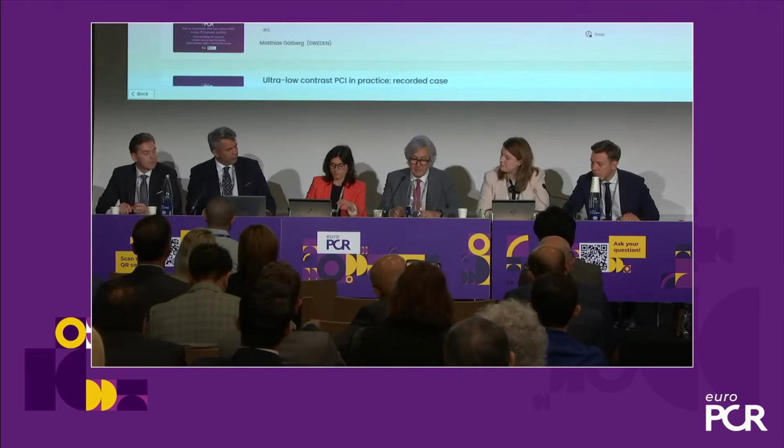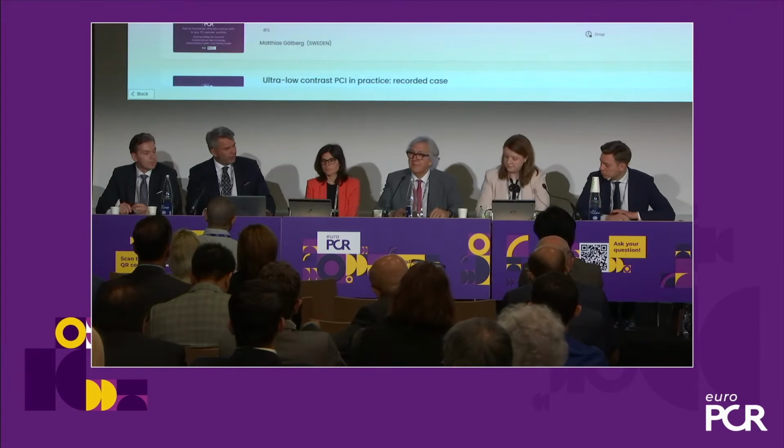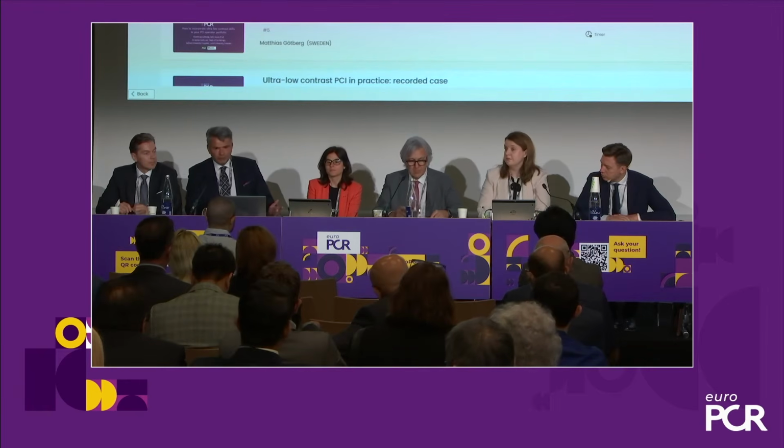And from there, trying to understand what the situation is, and perhaps proceed as much as you can without injection. In the right coronary artery, you can use 1 or 2 injections. But it's a good example that certainly these patients with an acute coronary syndrome are the ones that may be more prone to develop, as you know, acute kidney injury, irrespective of previous renal function. And moreover, with patients in acute MI, usually we don't know the GFR. So patients are coming and you don't know.